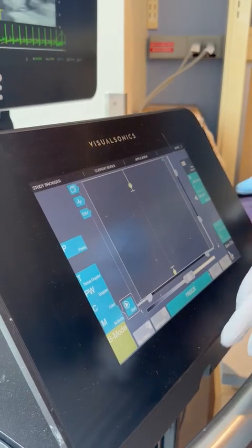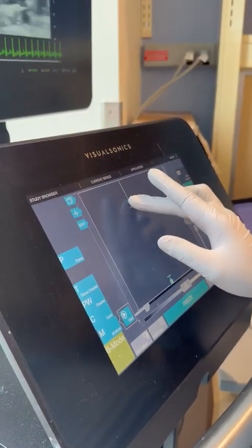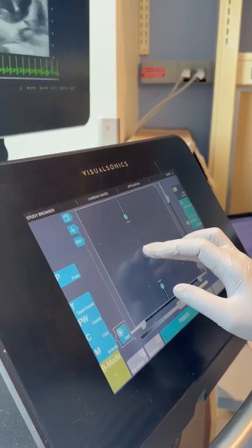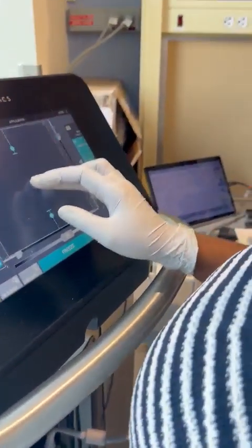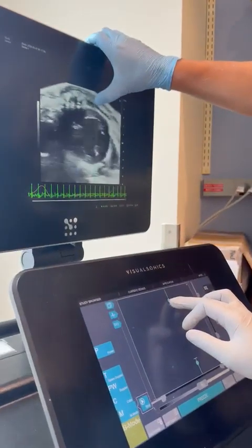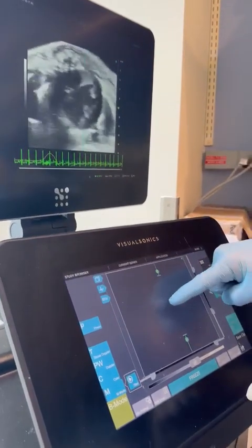And then just click on the dotted part and bring it right to the middle of the heart. If you click on the dotted line, you can slide the whole line over to the right. Nice. So we're going to bring it right to the middle. Right to here. Perfect. And then now you can bring it so that this is out here, outside of the heart, a little further. Perfect. And now I'm just going to move this back a little bit.